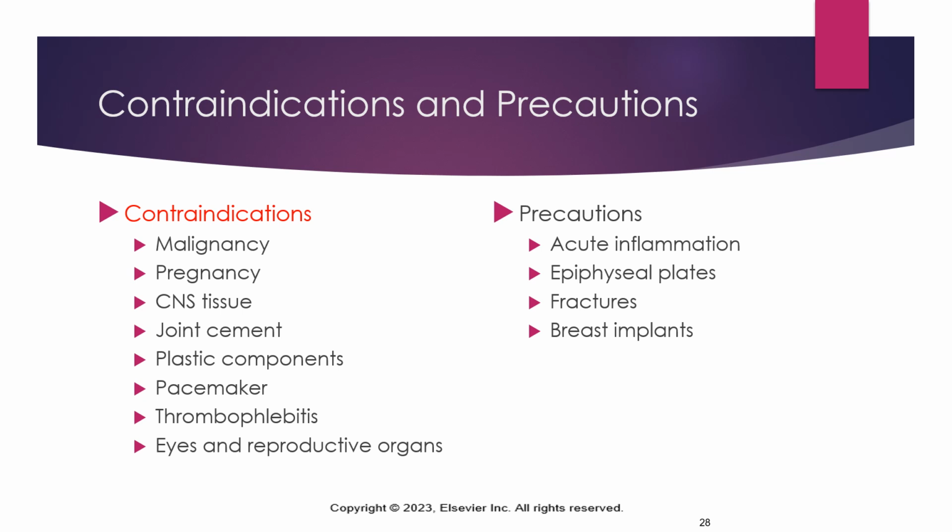Some of the precautions that you might want to use would be acute inflammation. If somebody has acute inflammation, it's not a for sure no, we can't use therapeutic ultrasound, but we're going to use the correct form. We're going to use a non-thermal form to maybe modify inflammation, but we're not going to use thermal settings. We really want to stay away from the growth plates in young children. We don't want to stunt their growth or have any effect or injure those areas at the growth plates.